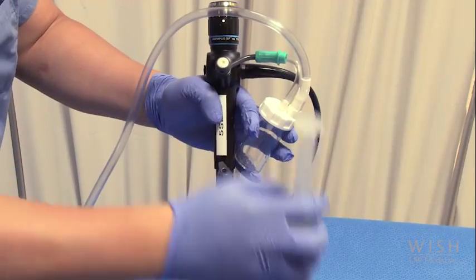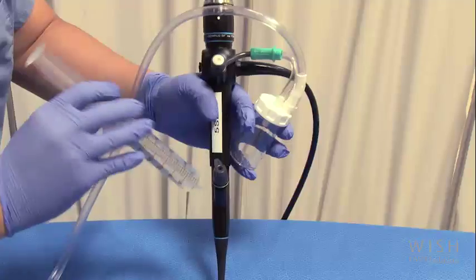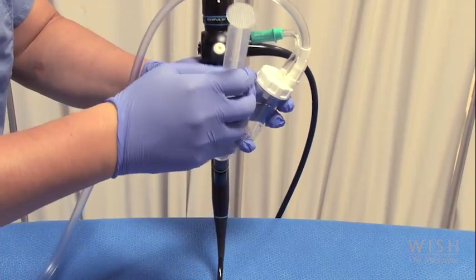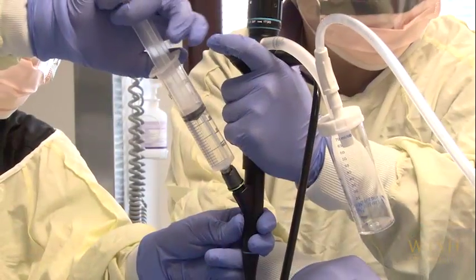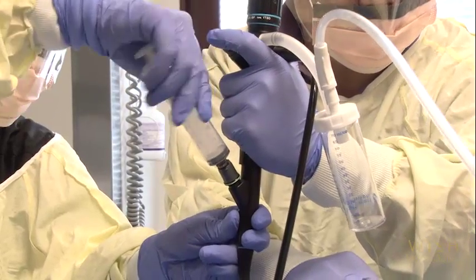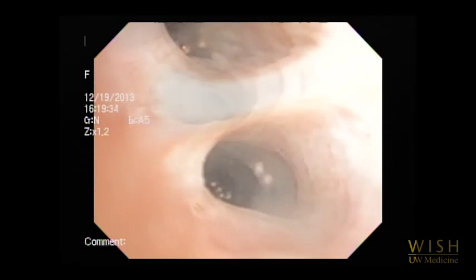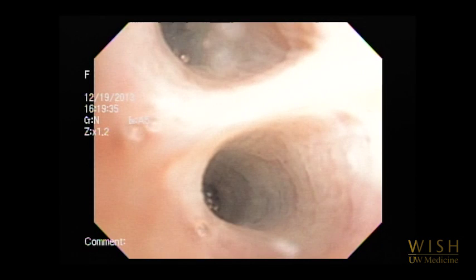Once the bronchoscope is in an appropriate position, 30-milliliter aliquots of sterile saline are instilled through the wedged bronchoscope. The total volume instilled is usually 90 to 120 milliliters. One should see the airway mucosa distend and blanch during lavage instillation, as shown here.